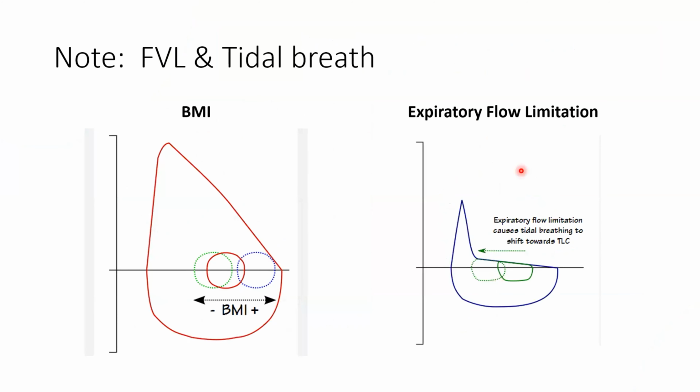The expiratory flow limitation, COPD patients, asthma patients, they might be inhaling more and exhaling less, and they could have some of their air being stacked up. And so you want to be aware that if their tidal volumes are moving toward the left as they do their breathing, that they are stacking, and you want to not have them do that. You can coach them to breathe more out.